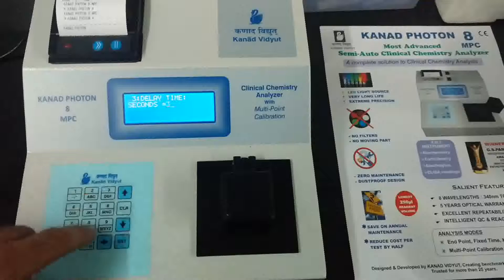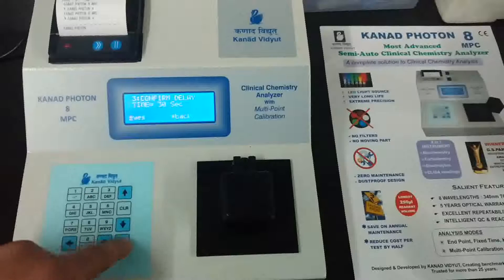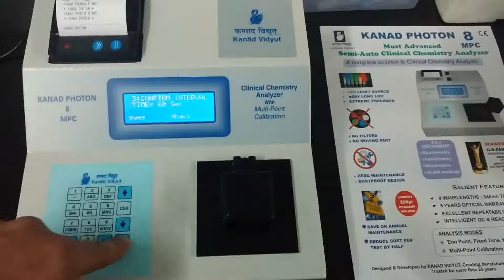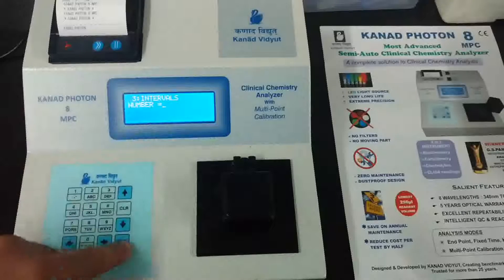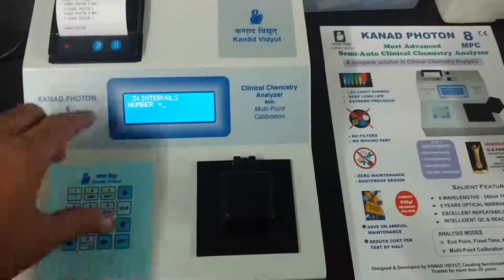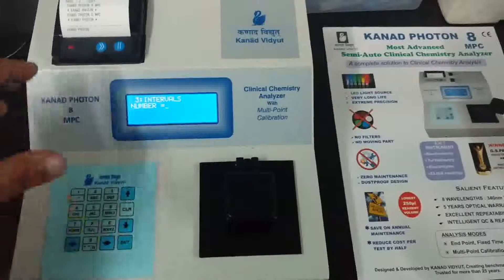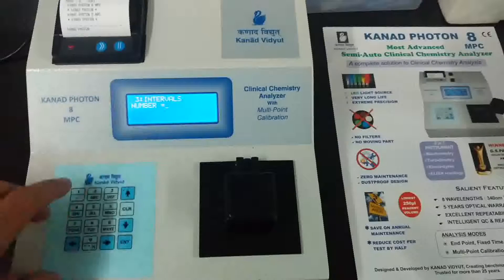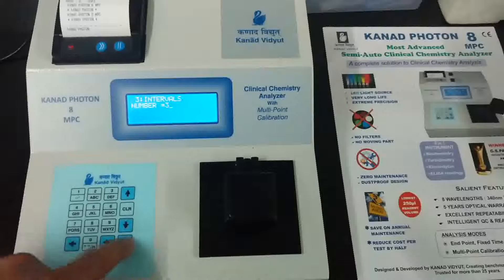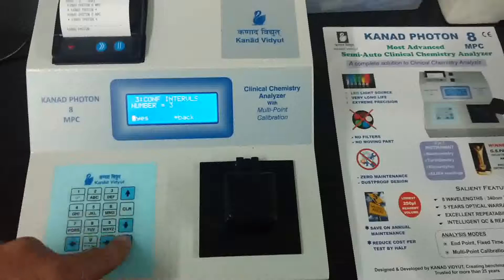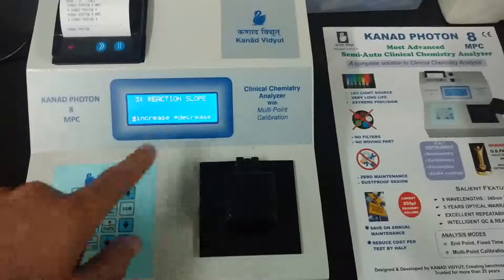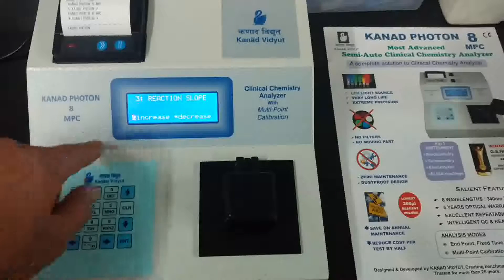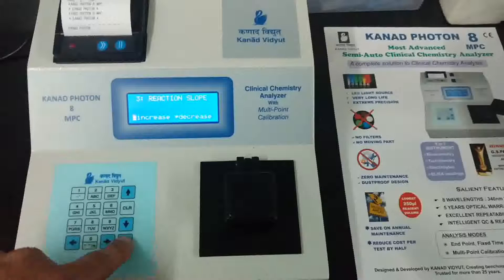Enter the delay time in seconds as mentioned in your kit. Then enter the interval time as mentioned in the kit. This is just a general walkthrough of the options the machine asks when entering new programming. Enter the number of intervals as mentioned in the kit parameters and confirm. Then select the slope of the reaction — decreasing or increasing — as specified in the kit.